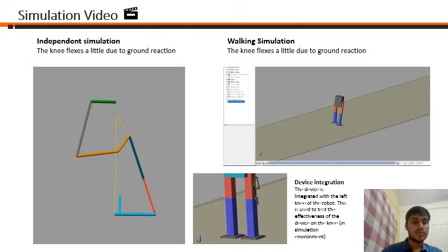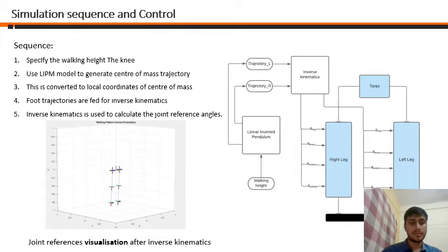The fully working simulation was created with the help of multi-body modeling in Simscape. Simscape is a numerical solver which effectively solves the coupled system of 6 non-linear differential equations for each body of the system. Each equation is for 1 degree of freedom of the individual body. This uses the generated trajectory from the inverted pendulum model to attempt walking on the ground.